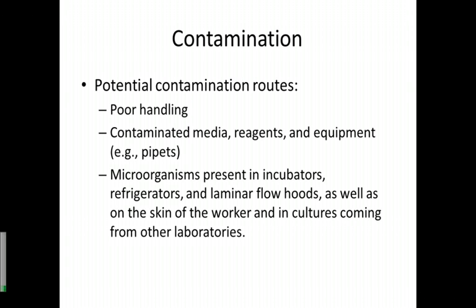So what are the potential sources of contamination? This might be due to poor handling or the techniques used to culture the cells. It may be caused by contaminated mediums or reagents or the equipment that you are using. There also might be microorganisms present in the common storage areas like incubators, refrigerators, or the laminar flow hoods, as well as on the surface area of the skin of the worker or in cultures coming from other laboratories.